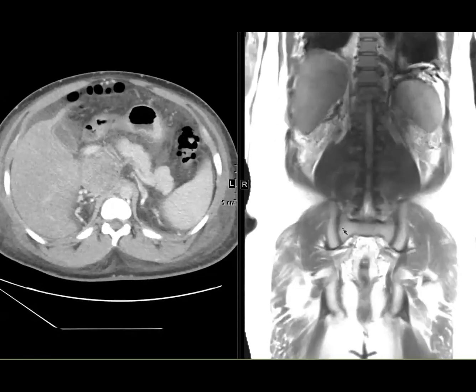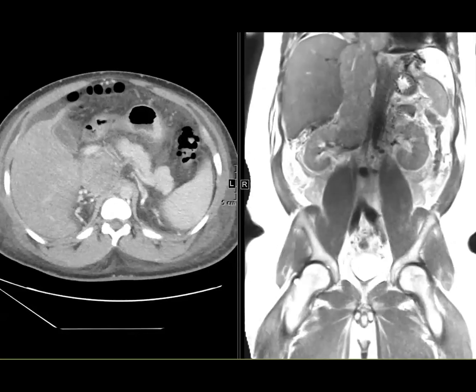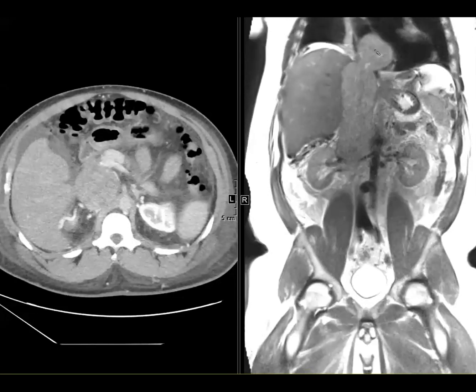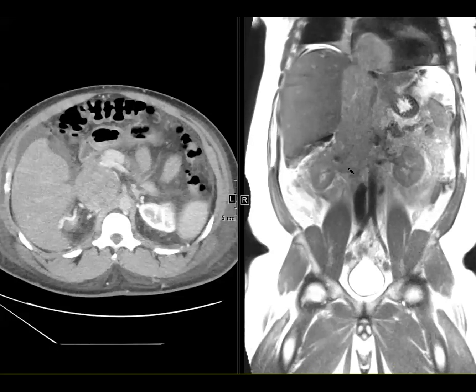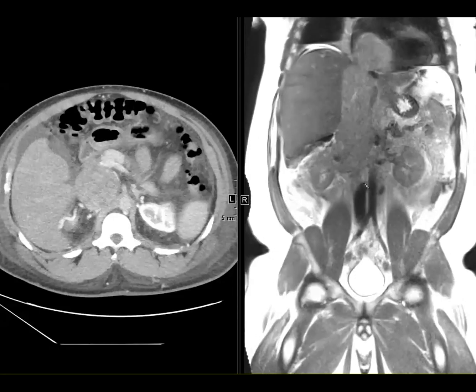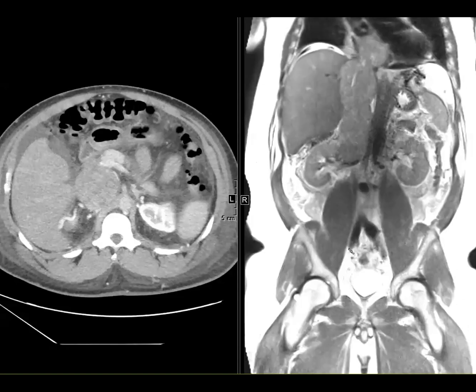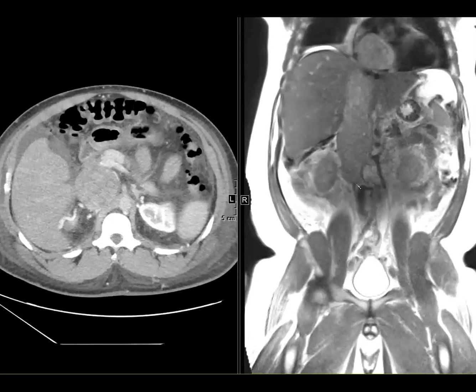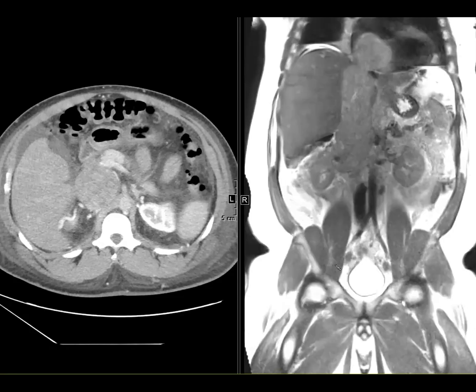And this is how it looked on MR. And the MR was helpful because, as I said, there was that mottled flow below it. Here on the MR, we can see that evil gray of tumor expanding the IVC, extending into the renal vein, but didn't arise from the kidney. So we really thought it was an IVC leiomyosarcoma. And then we can see that the flow void of the IVC below it is preserved. So there's no bland thrombus below it, and it just goes right into that tumor.